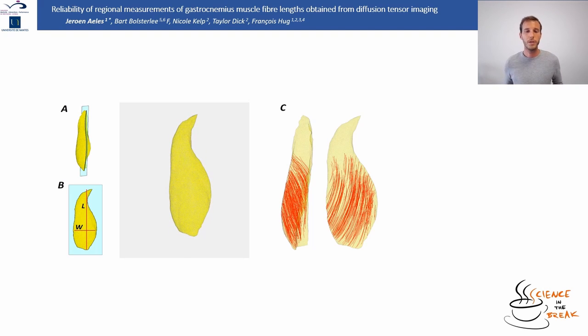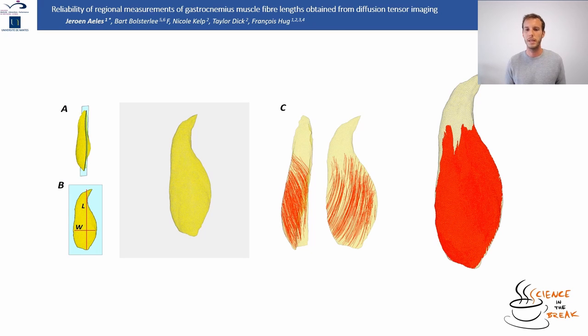So now we'll introduce the muscle fiber lengths on the right. You can see them here nicely in red. Take into account that this is maybe 100 fibers or so. We have a lot more measurements. We usually measure a few thousand fibers, but I only imaged a few, because this is, I think, maybe 1,000, so obviously it becomes really hard to see anything on it.